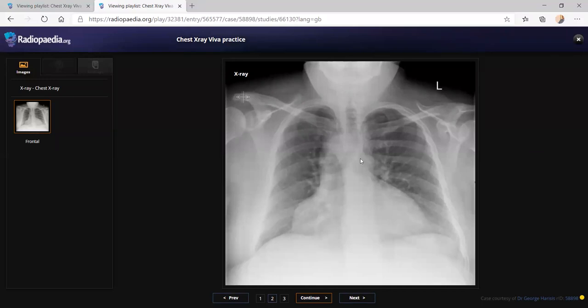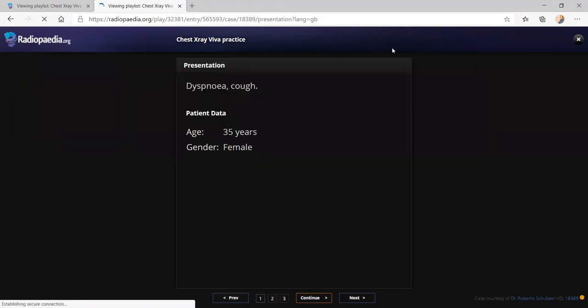The left side, you mean this one? If this is dextrocardia, then what are you seeing on the left side? This is a very large heart, or maybe a fat pad, or maybe a pericardial cyst. And the patient actually is asymptomatic. So maybe a CT chest would help in further evaluation if there's clinical concern.